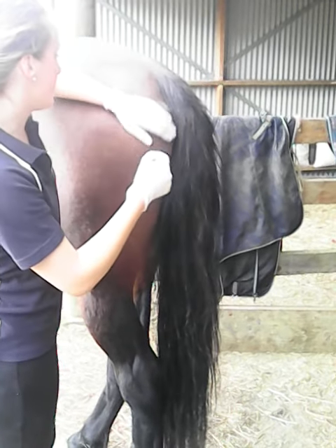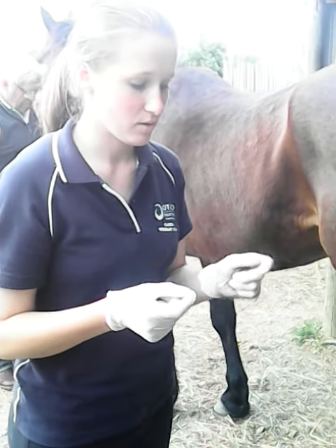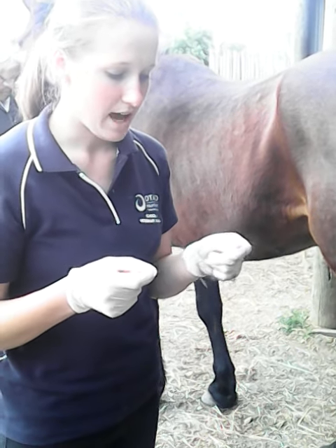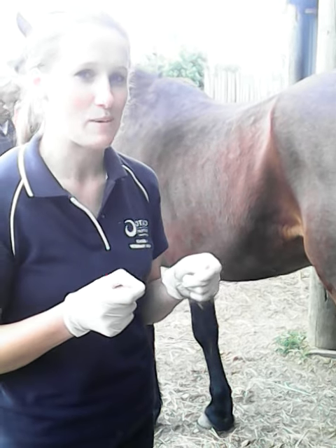Make sure the horse is still calm. Step away from the horse and wipe away the faecal matter and the lubricant. Make sure you read it carefully, confirm it is the right temperature, and record it down. Never rely on memory.